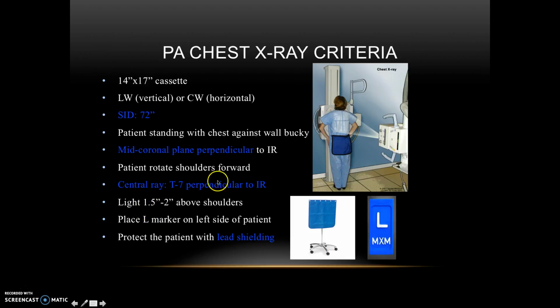We're going to have a little bit of light above the shoulders, about 1.5 to 2 inches above the shoulders. We're going to be placing a left marker on the left side of the patient. So we see a marker here, and we're going to place it on the left side of the patient.